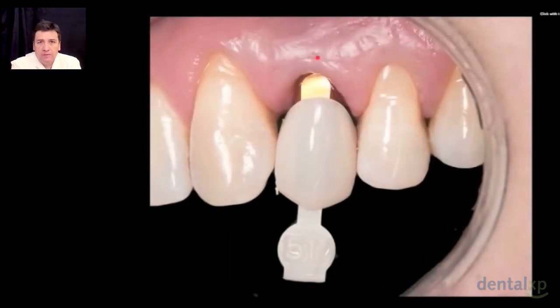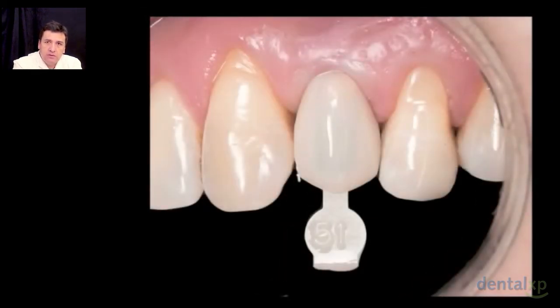Now, with the new provisional, in this case directly to the abutment and directly to the implant, we have to preserve the contact points like we are seeing right now, and we have to be very sure to select the adequate crown to be adapted in a proper way to the abutment, and to avoid overpressure on the soft tissues and creating ischemia.